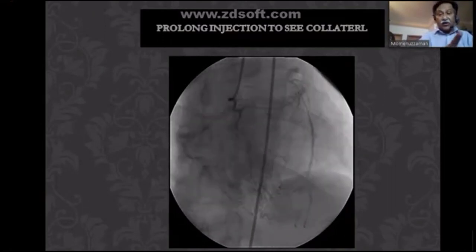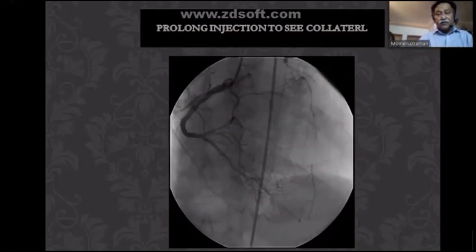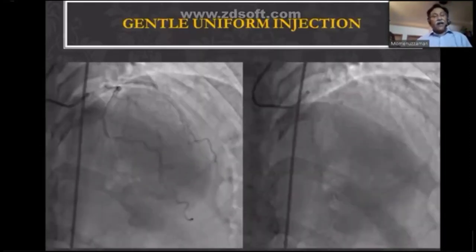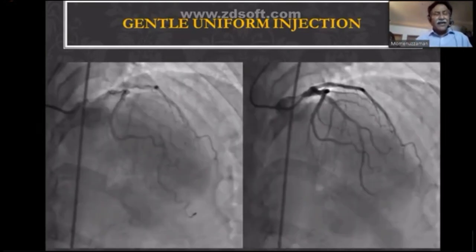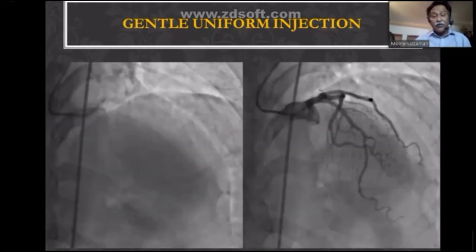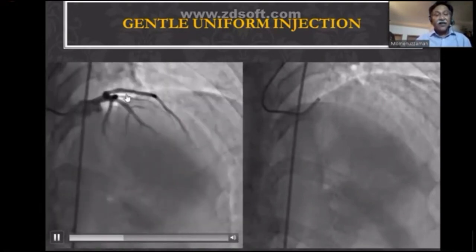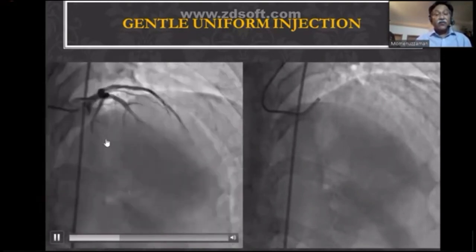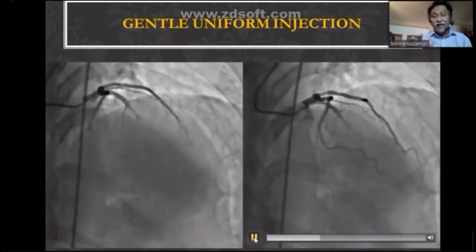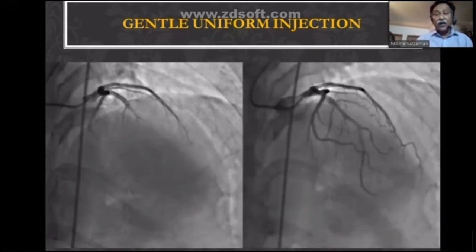Is it a patient with a total occlusion of the LAD, being retrogradely filled by the RCA through its PDA and also conal branches? Sometimes, as the diagnostic catheter has little backup support, if you push too much, there will be back bouncing of the catheter and more of a sinus flush. Little dye will enter the coronary artery for proper visualization. So in that case, you need to give sustained and uniform pressure of injection so that the catheter will not bounce back.